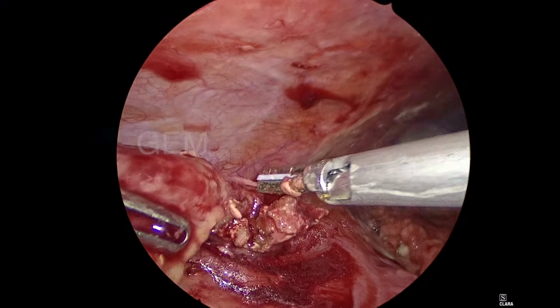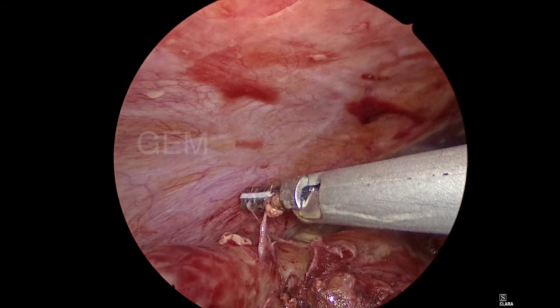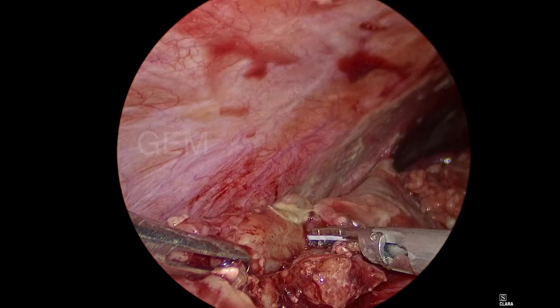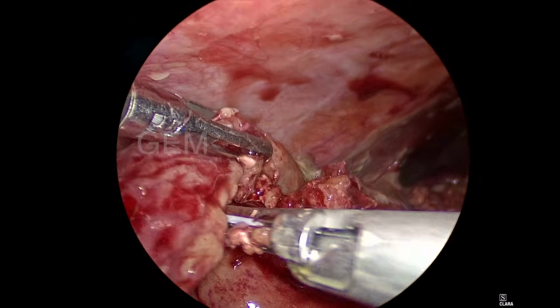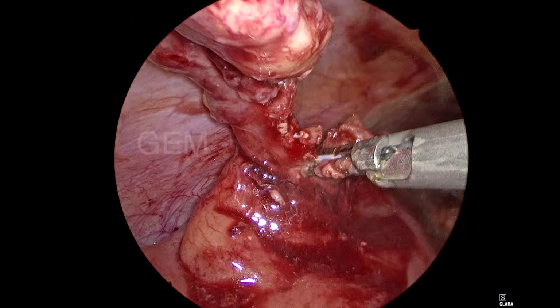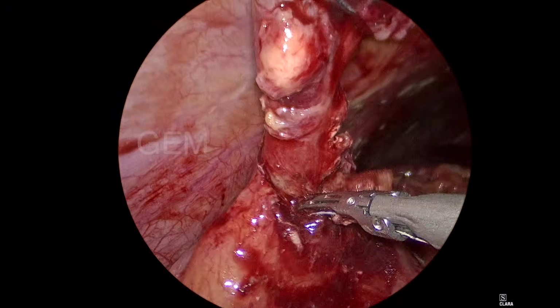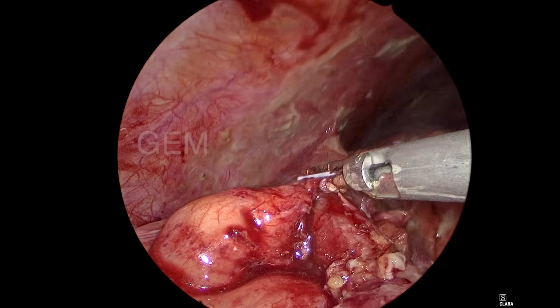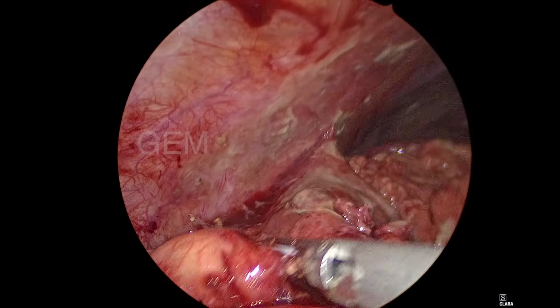From here everything is fixed. You can see I am dividing the peritoneal covering of the appendix. I am separating the cecal wall from the appendix, and the meso appendix is also there. So here I am dividing the peritoneal reflections.